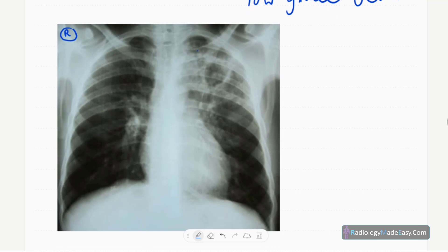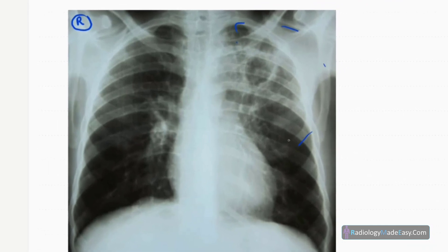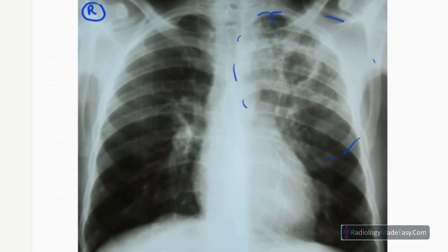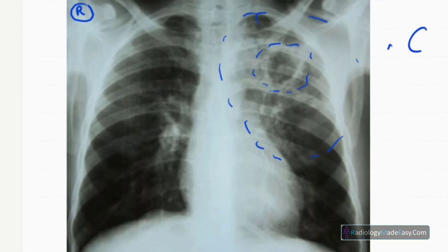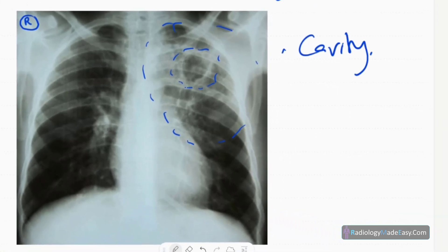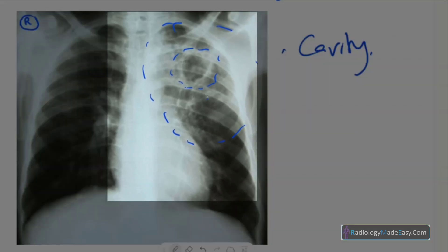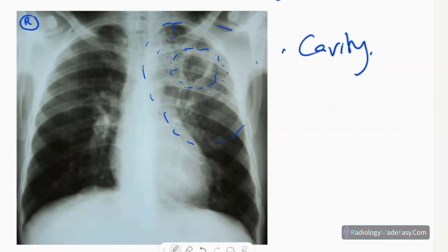You can see an abnormality over the left upper zone here. There is a cavity with a relatively thick wall. Surrounding the cavity, there are ground glass opacities and a focal area of consolidation with an air bronchogram.